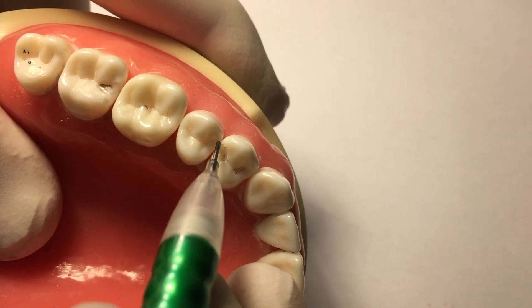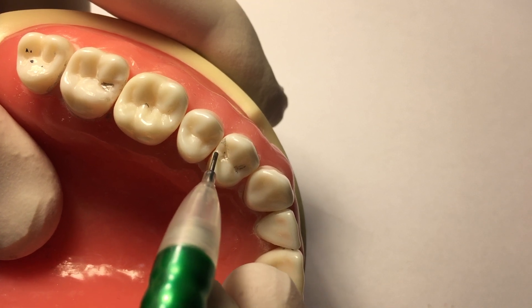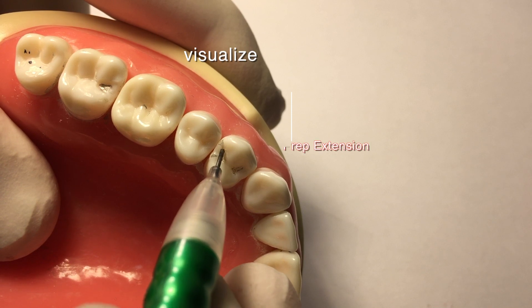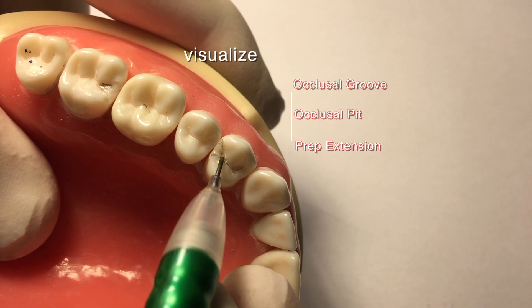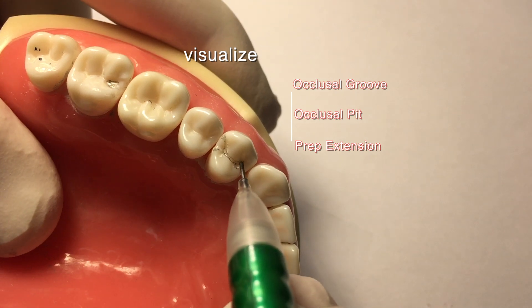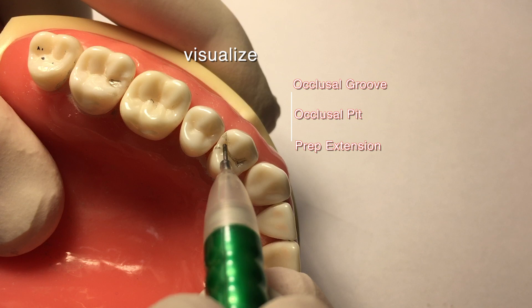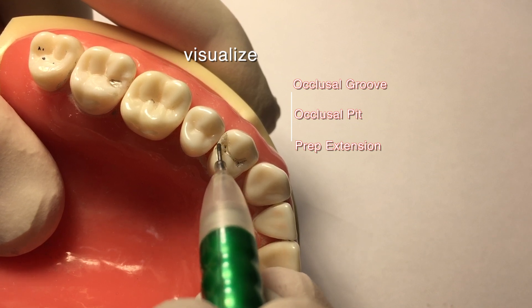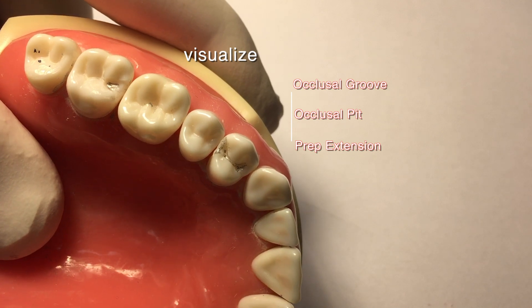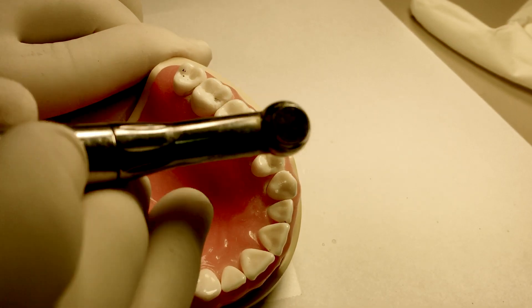A very important step in any restorative dentistry procedure is being able to visualize the prep at hand. In this case, we have to visualize where the occlusal groove, the occlusal pit, and especially the prep extension are located. Transferring that ability of visualization to the instruments we'll be using.